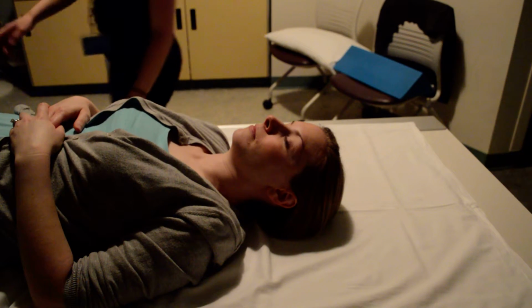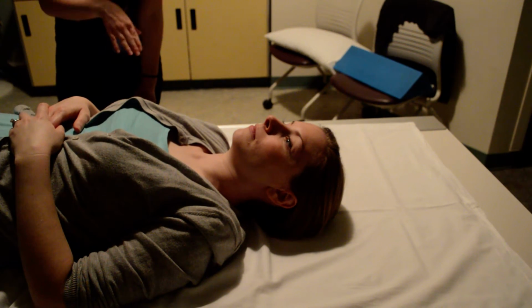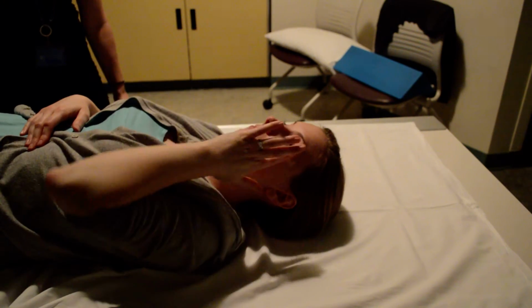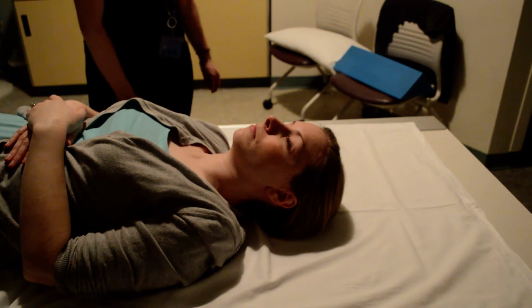Okay, we're going to start with the reverse Waters, which is a trauma position. That means that we can't manipulate our patient's head at all. So in reverse Waters, we utilize the MML. Since we can't have our patient extend their head, what we're going to do is match their MML.